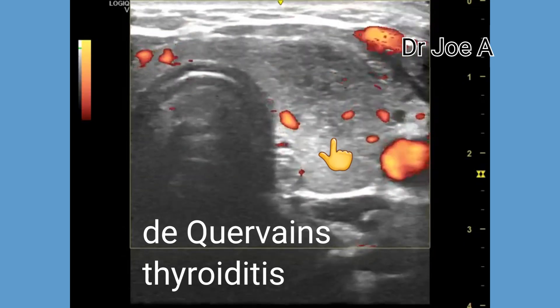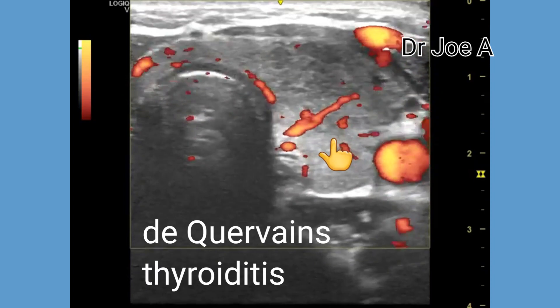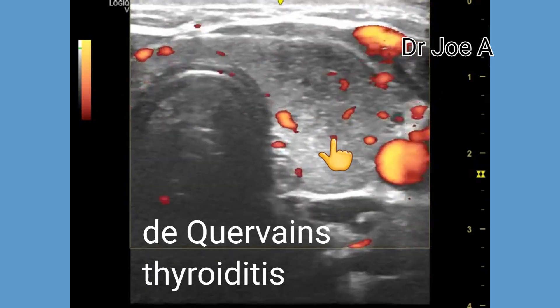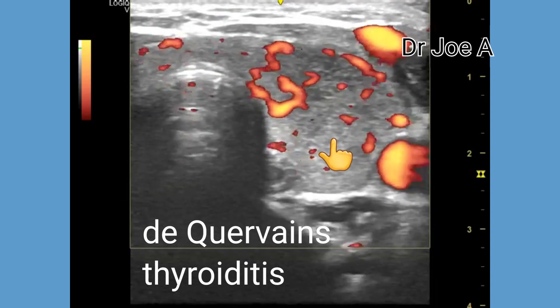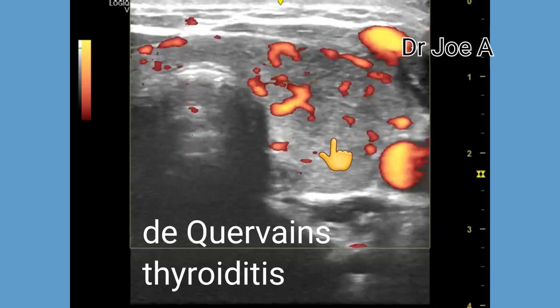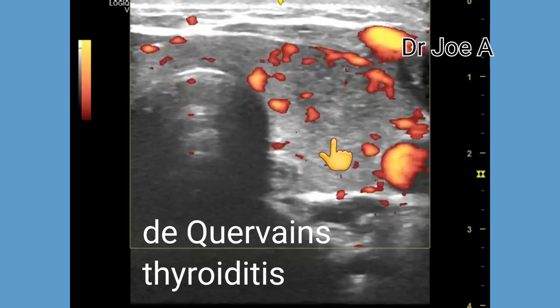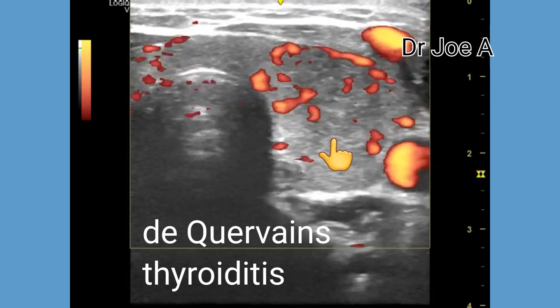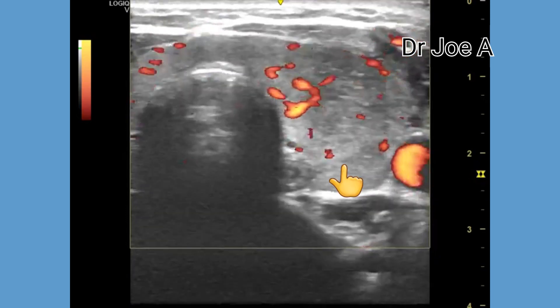Ultrasound images show a hypoechoic, enlarged, edematous left lobe of the thyroid with a heterogeneous echotexture. This affected area is about 1.7 cm in diameter. There is also evidence of increased vascularity, indicating inflammation of this part of the thyroid.